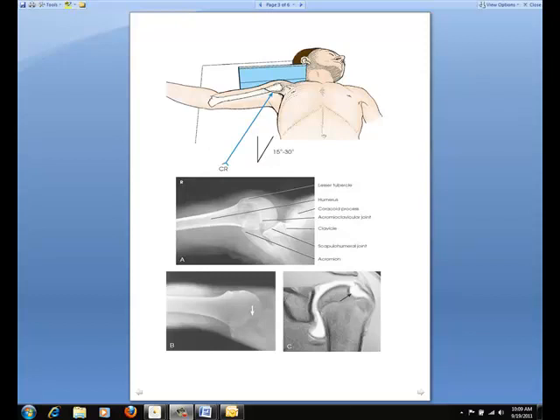You may wish to have the patient turn the head away from the side being examined so the IR can be placed against the neck. Place the IR on edge against the shoulder as close as possible to the neck, and support it with sandbags or a vertical IR holder. Direct the central ray horizontally through the axilla to the AC articulation. The degree of medial angulation is often between 15 and 30 degrees — the greater the abduction, the greater the angle.